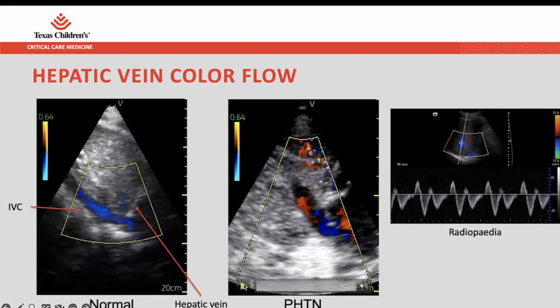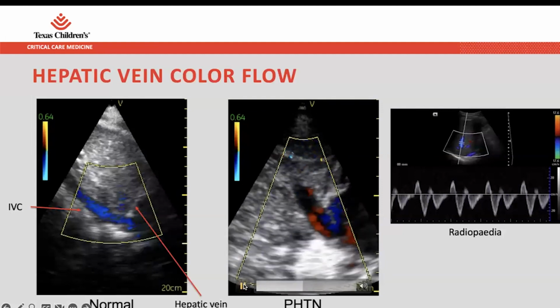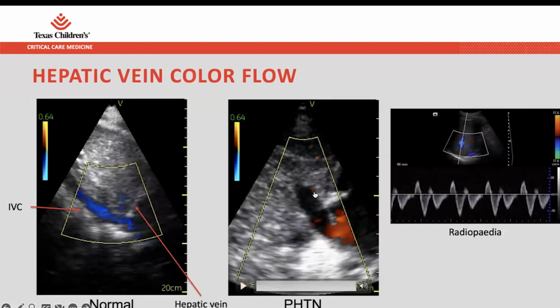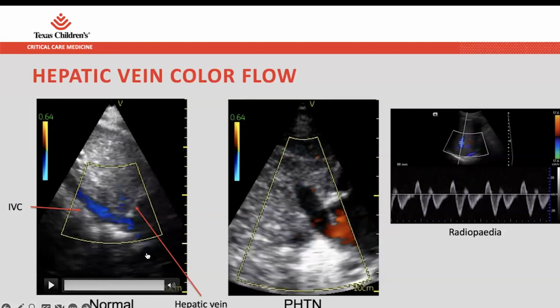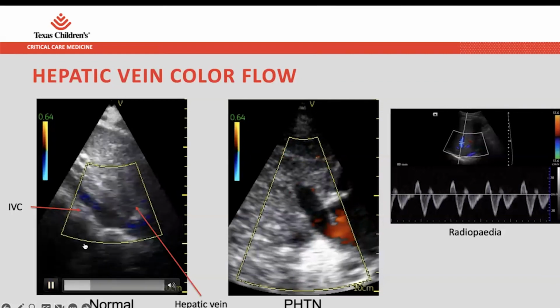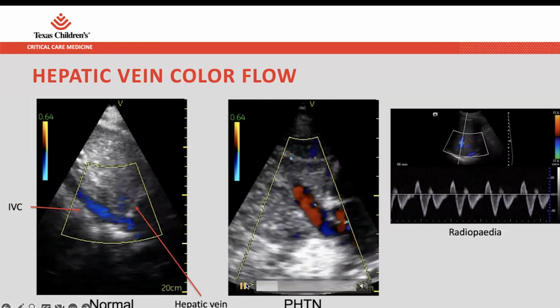This is in pulmonary hypertension, which generates a signal not unlike what we might see in a congested VExUS patient. Instead of seeing uniformly blue flow away from the skin and towards the RA, as in a normal state, we see oscillating flow. We see blue, red, blue, red, blue, red, with red being when systole occurs.